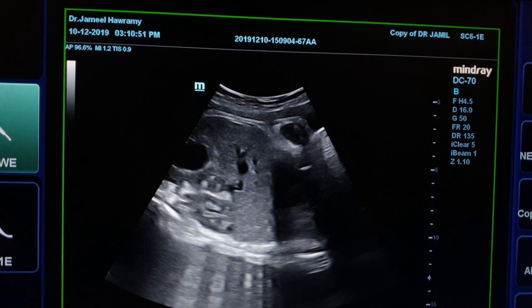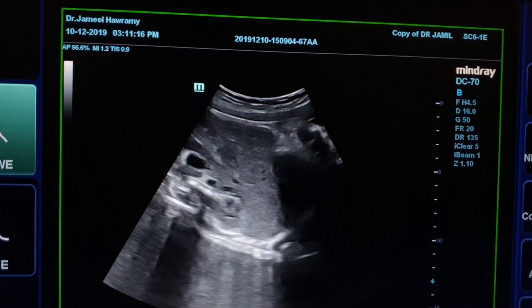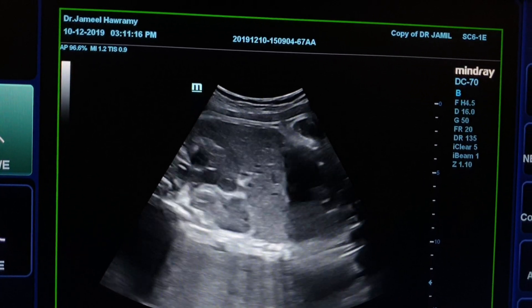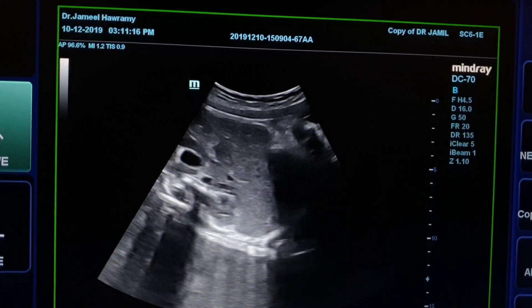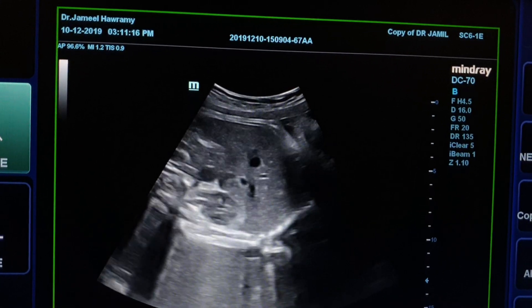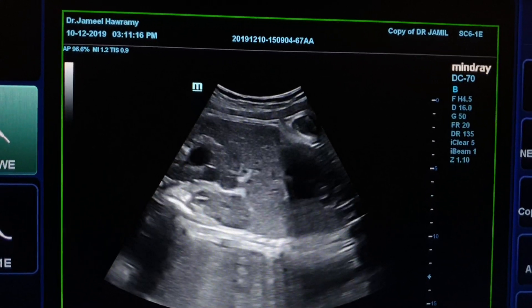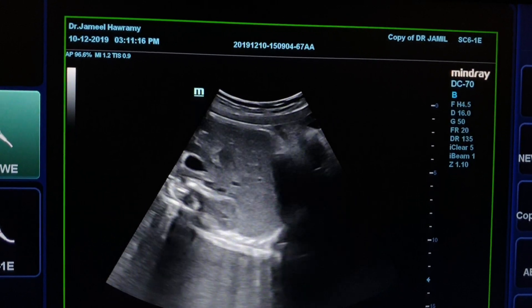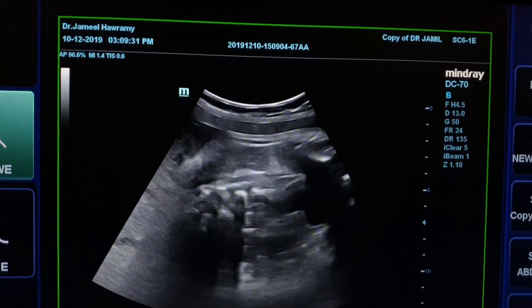In this short clip, we see the hydronephrotic left kidney and right kidney, both in transverse and longitudinal section.